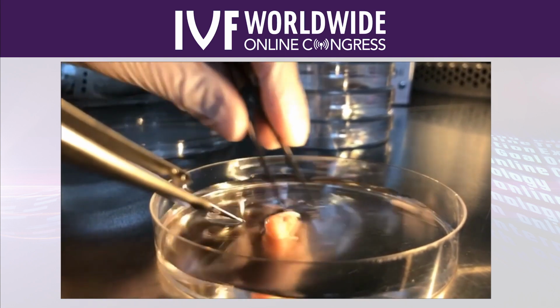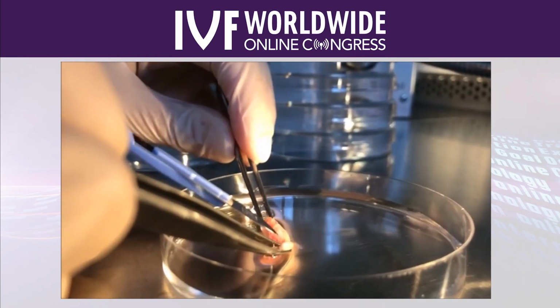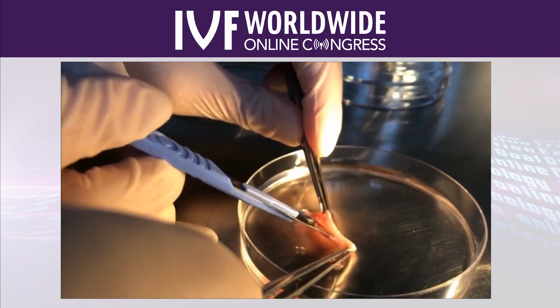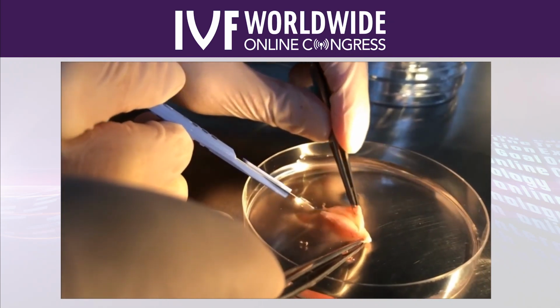And here's the little ovary from the 3-year-old girl. And you can see it's a little thick in the middle there, so we are trying to open it up to cut out some of the medullary part. So here we are cutting it into 2 halves.